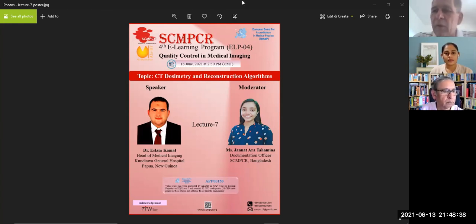If you are living close to the vendors, like in Erlangen in Germany, where Siemens has a huge factory, of course the people from Erlangen have very good access to the beta or alpha releases, but we do not. So we have a hard time. The physics mode enables us to do a little bit more research on what I would call future developments, like looking at the modulation transfer function, for example.